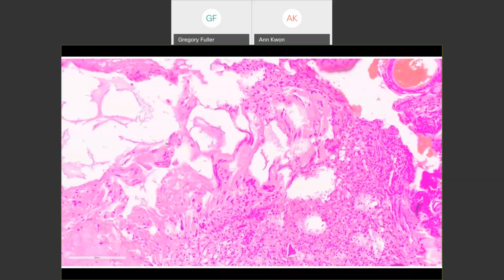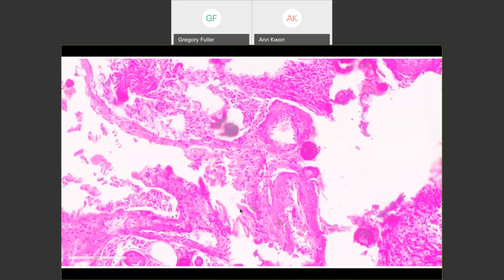Okay. Now I'm progressively making it a little bit easier with each one. Again, can everybody see? Right here, we're looking at these guys. Look along here. All right, out here, down here. No, not yet. Okay, how about this? Recognize it yet? Check out right here in the center. Everybody see that? Look over here. Look right here. See these fragments? Now I'm handing it to you. Also, what is this? Out of focus in the center. What is that? Anybody putting it together? What is the tissue? The question is, what is the tissue? Now, keep in mind, these cells that you're seeing here are being distorted by cautery artifacts. So you have to take that into account.